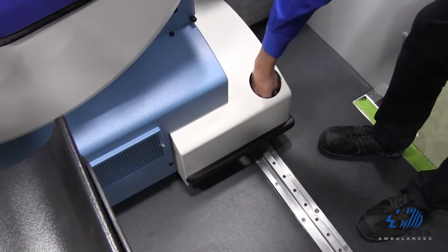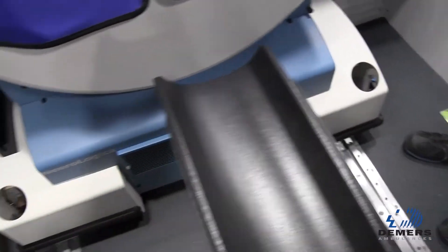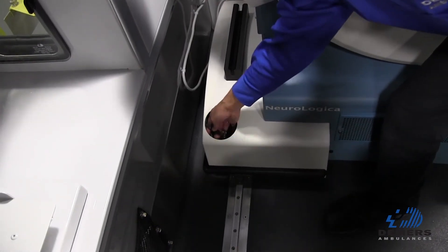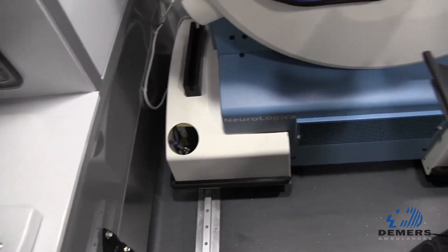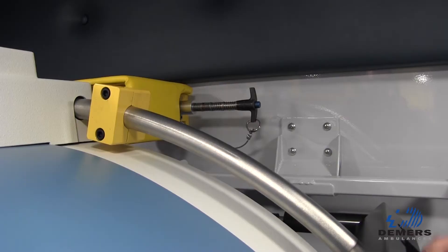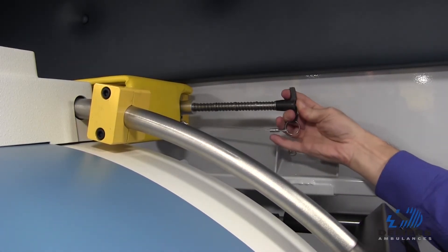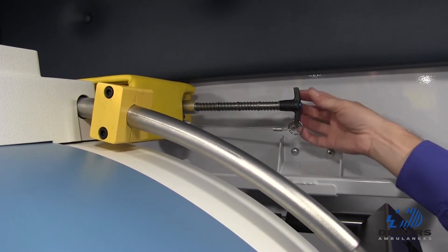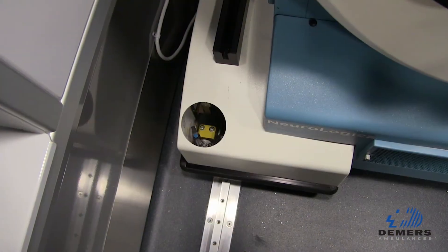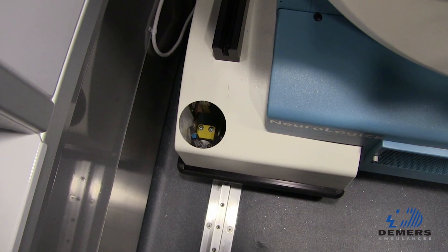Another innovative aspect of the design is how we've been able to integrate the anchoring system of the scan into the vehicle. What the team was able to do was to hide the anchoring system underneath the side skirts of the scanner, so it makes for a much nicer, cleaner look. We've eliminated trip hazards, and the functionality of these systems is also very simple for the user.